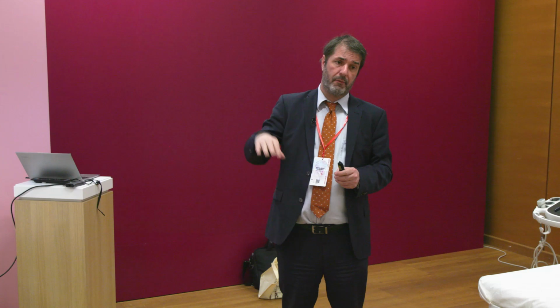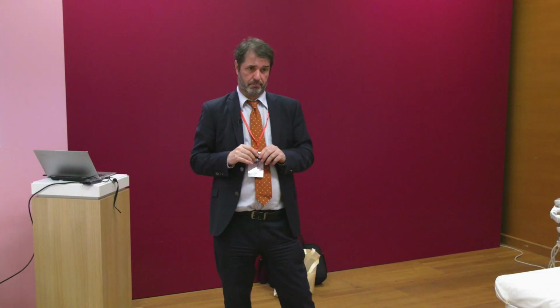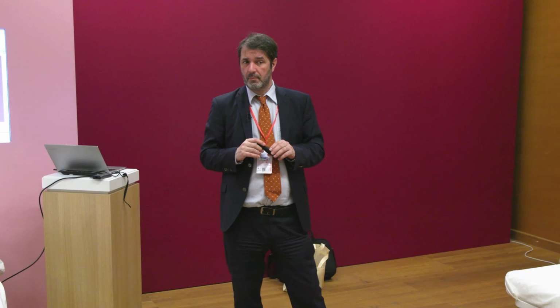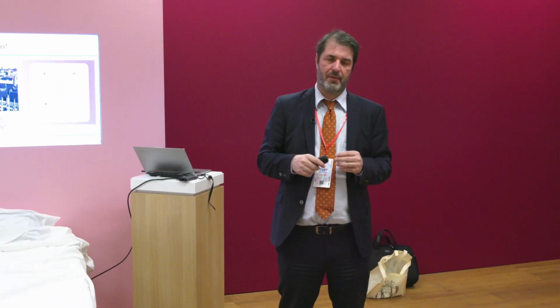Also, Philips have migrated from a high-end system to a mid-range system. It's available either for diagnostic, also for intervention. And with this system, there's only advantages. What are the challenges with this kind of technology? It's not a challenge. It's an additional tool. So you combine two advantages. So it's perfect. You just have to do it. That's the only hook. You have to start, and once you have done this, it's very fast.